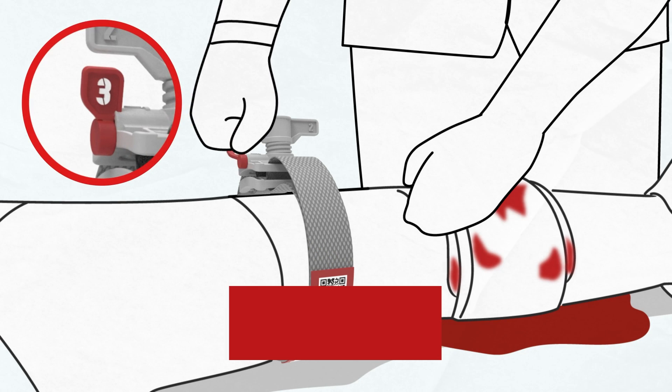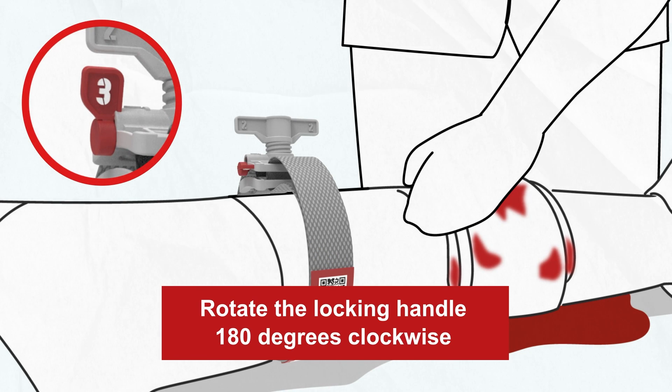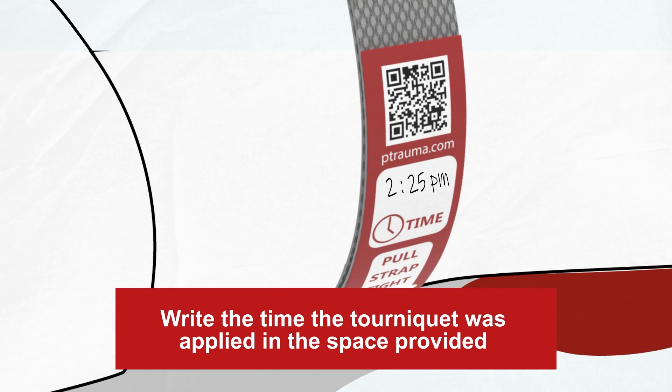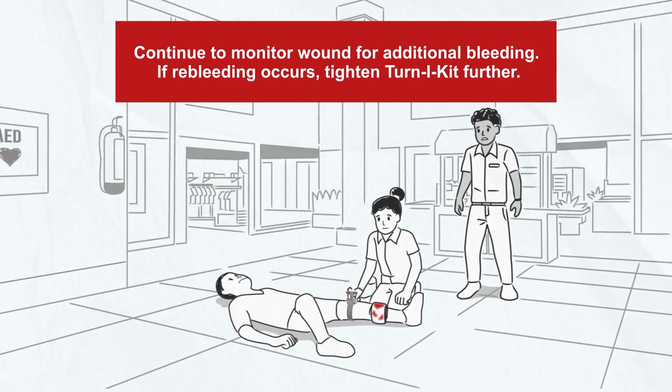Step 3. Turn the locking tab marked with a 3, 180 degrees clockwise to lock the handle. Mark the time on the space provided on the end of the strap. Continue to monitor the wound for bleeding and tighten the tourniquet further as necessary.